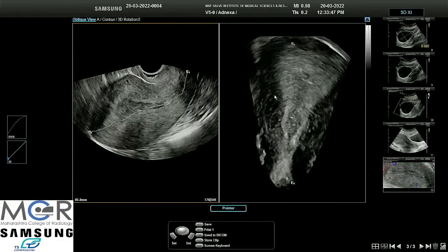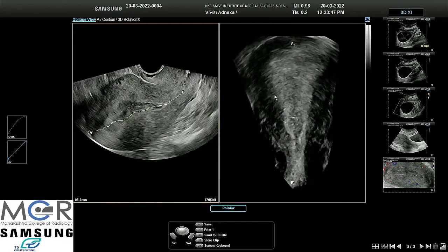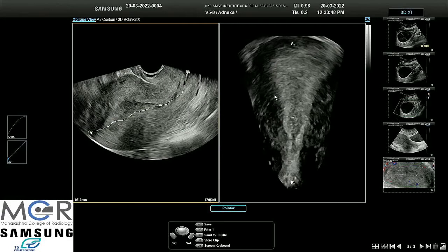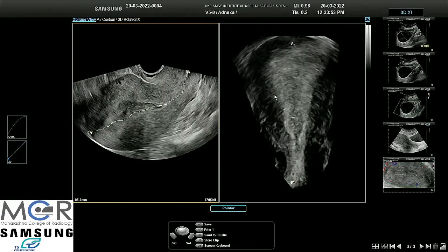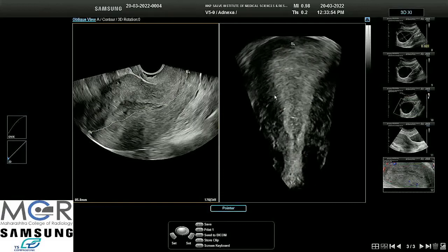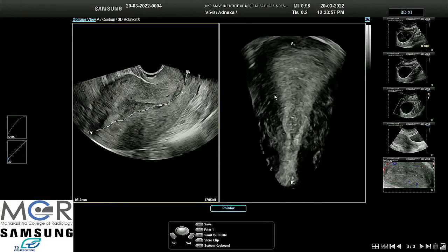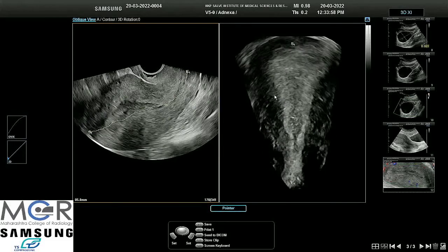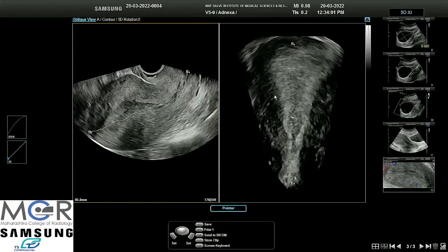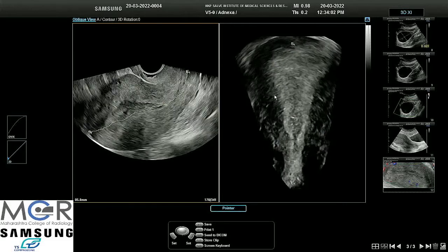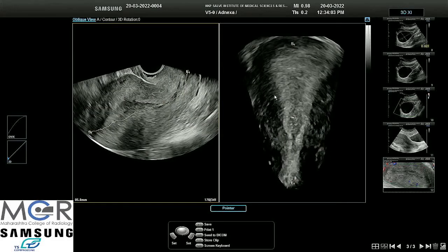These spaces are the places where the endo-myometrial junction is indistinct. 3D helps you a lot if you are able to make out the diagnosis. A good 2D image may suffice, but if you have 3D then it will add to your precision of diagnosis.